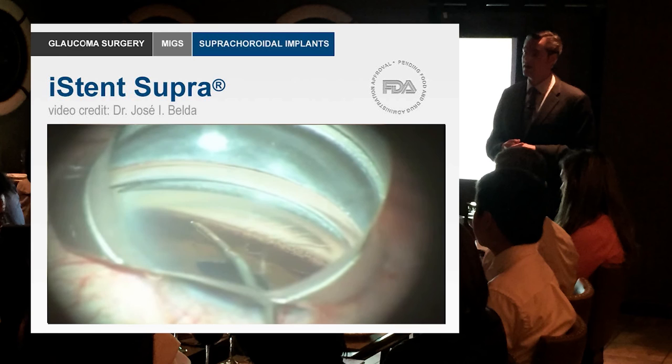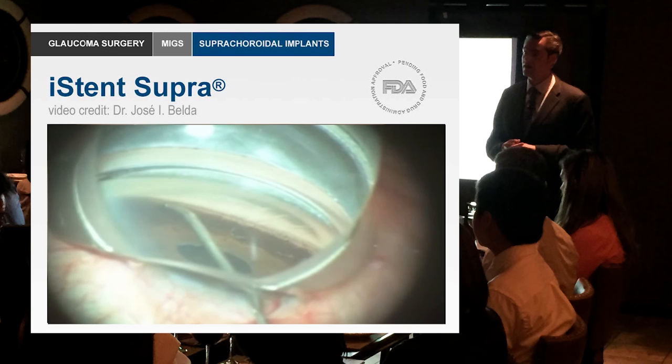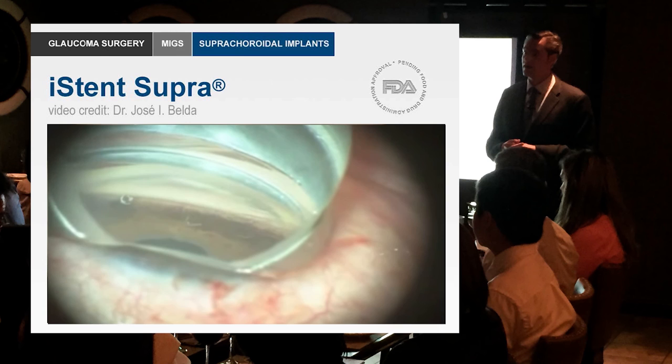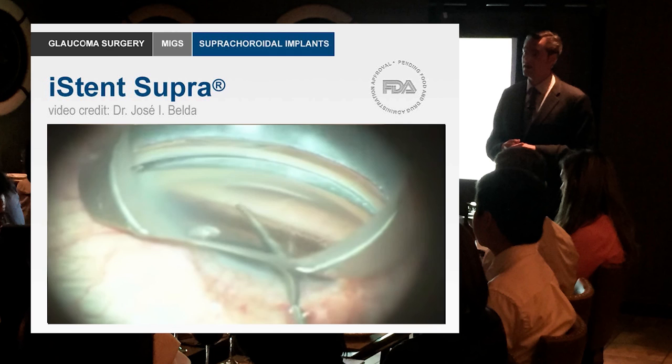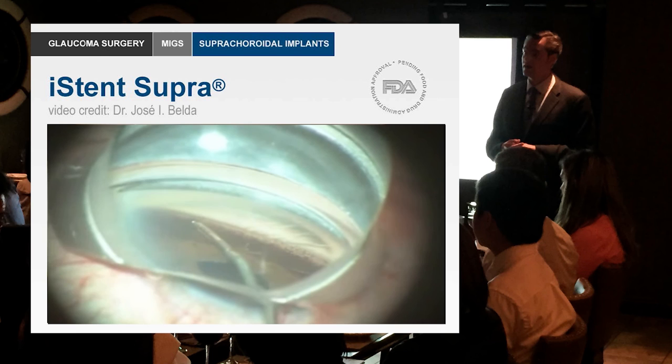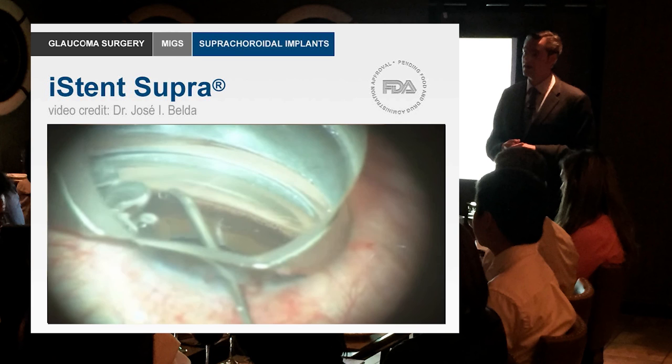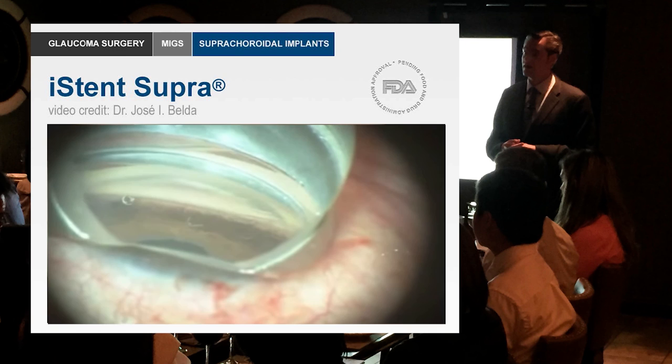Dr. Jose Belda demonstrates a gonioscopic view, inserting the iStent Supra right into the angle — and there it is. You can see the titanium collar sticking out, with the rest of the device in the suprachoroidal space. Whereas the Star Flow required cutting down and maneuvering along the suprachoroidal space, the iStent Supra is simply injected into that space, making it a really elegant device.